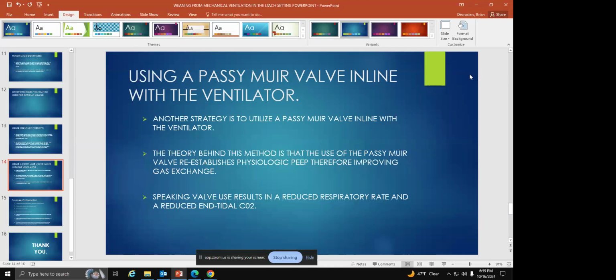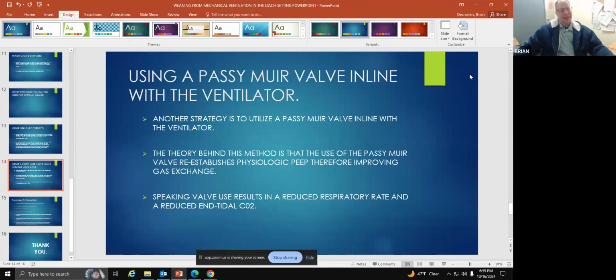And I have, like I said, yet in 20 years to meet a pulmonologist who is in favor of inline PMVs. Yes. So to speak on that, I have also been in the field for 20 years, and I have also not met a willing pulmonologist to use an inline PMV.